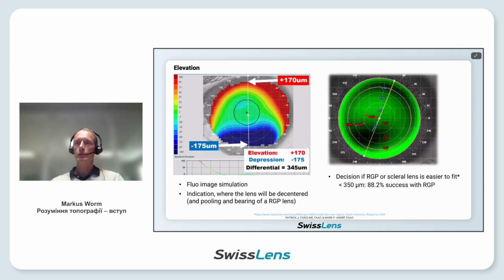Then there's an interesting study and a rule for deciding if the fitting of an RGP lens or a sclera lens will be easier to manage on a specific eye. This can be helpful for an irregular cornea. For this evaluation, you just take the difference of the maximum and the minimum height, meaning the most positive value minus the most negative value, like in this example, showing plus 170 as the highest value and minus 175 micron as the lowest value.